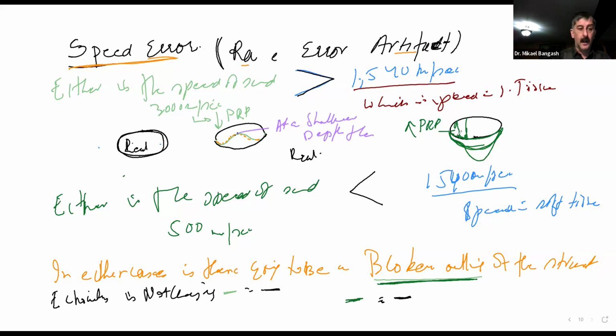Likewise, you're not going to have a fake number of reflectors appearing, lower or greater. One boundary is just going to produce one reflection.